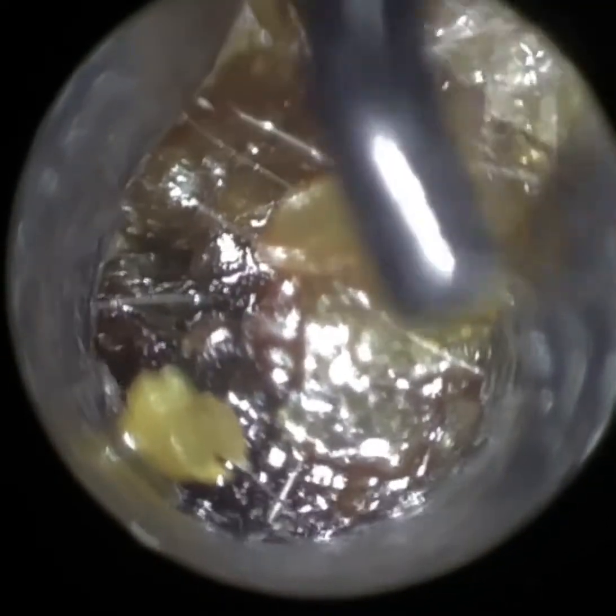Once more, we're just using the speculum to dilate the ear canal. Just having a good look around. I've gone in with the hook — you can see the angle I went there. I just glided it into the slit, and then once through the slit I rotate it counter-clockwise, anti-clockwise, and glide it. In this instance I went to the roof of the ear canal. When I pulled the hook through, there was a bit of a juggernaut action — it broke some of the seal created by this hardened keratin and a piece of keratin came out.